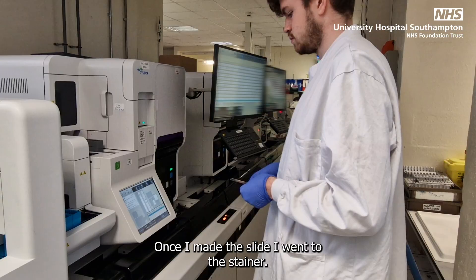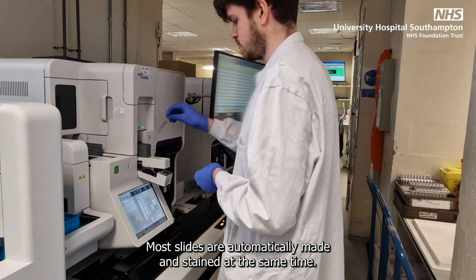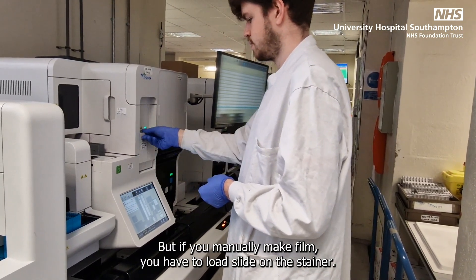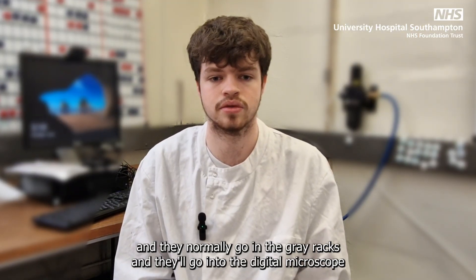Once I made the slide, I went to the stainer. Most slides are automatically made and stained at the same time, but if you manually make a film, you have to load the slide onto the stainer. When the slides are finished, they come out and normally go in the grey racks, and they'll go into the digital microscope.